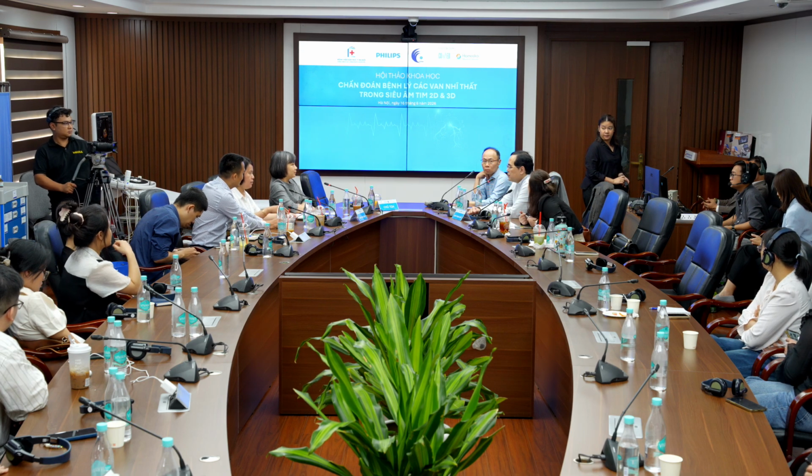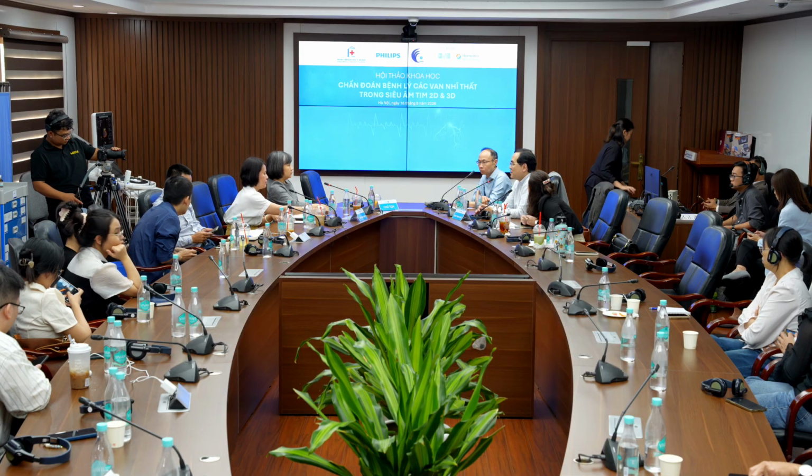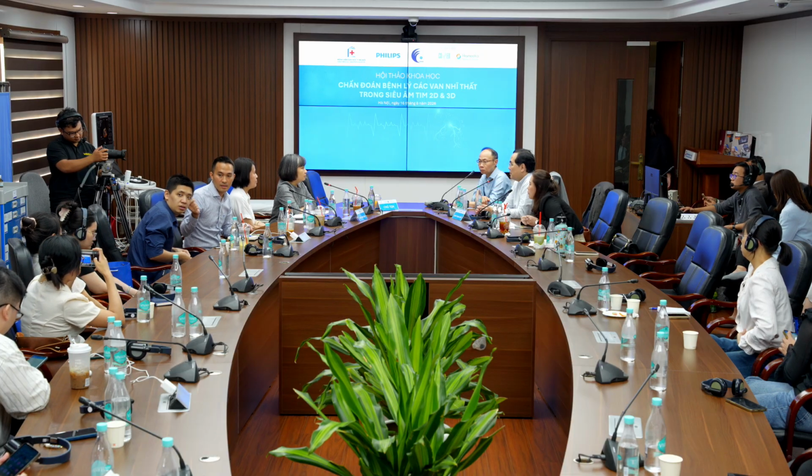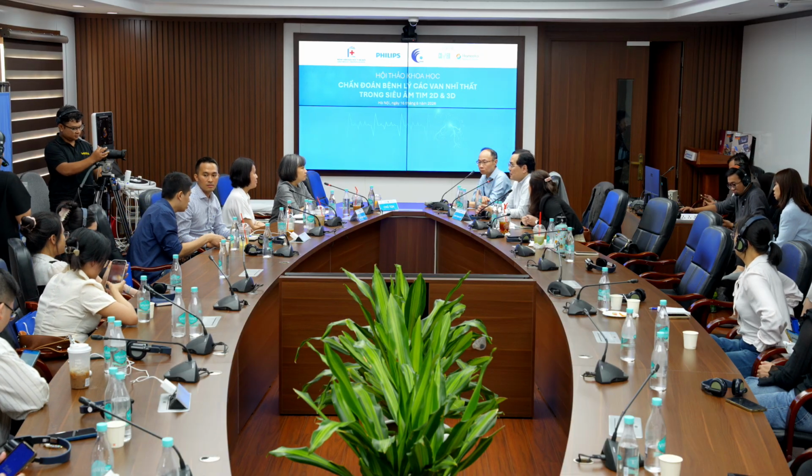Thank you. Okay, so if you look at the literature, the majority of tricuspid regurgitation is functional, up to 80 to 90%. So not surprisingly, in our center, the majority of the cases we are doing are functional tricuspid regurgitation. We have done a few cases of pacemaker-induced tricuspid regurgitation. We managed to reduce the regurgitation from torrential to moderately severe or even severe, but the patient functionally was much better. Less lower limb swelling, less liver congestion. So it definitely improves quality of life and reduces hospitalization.